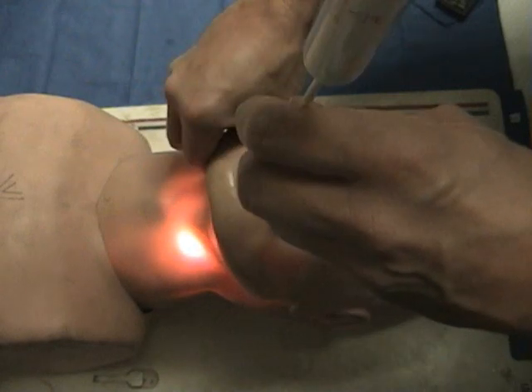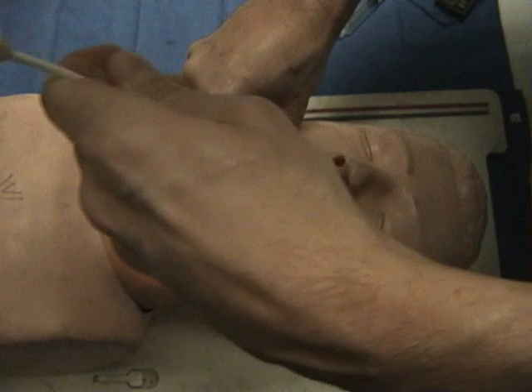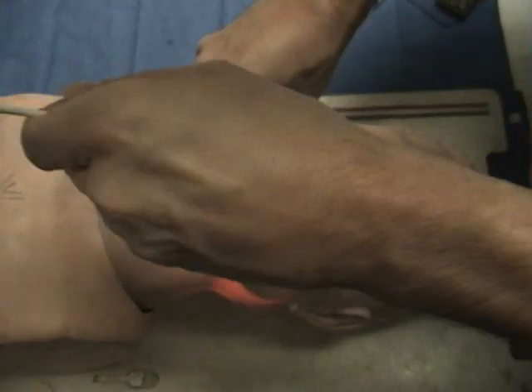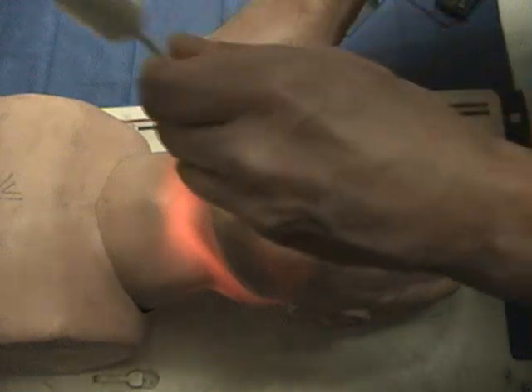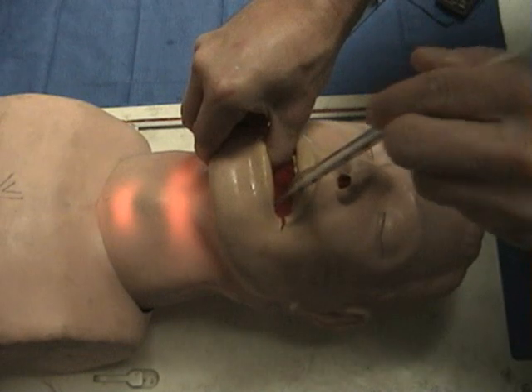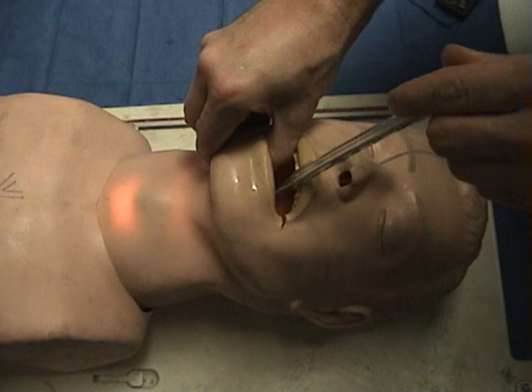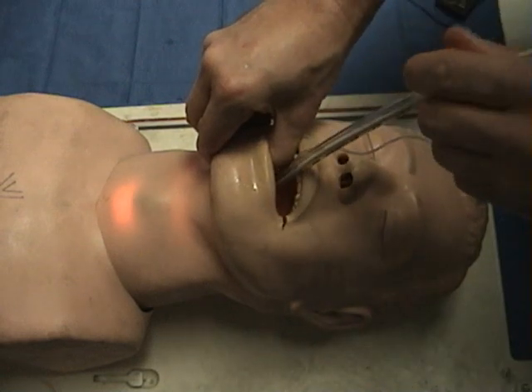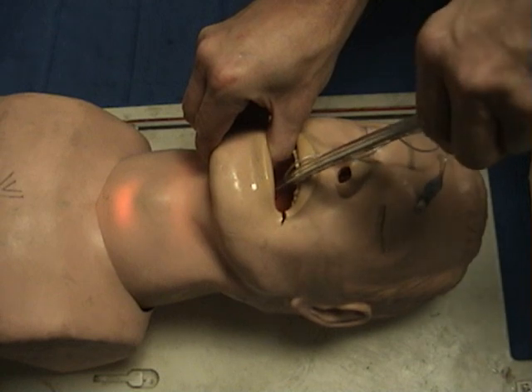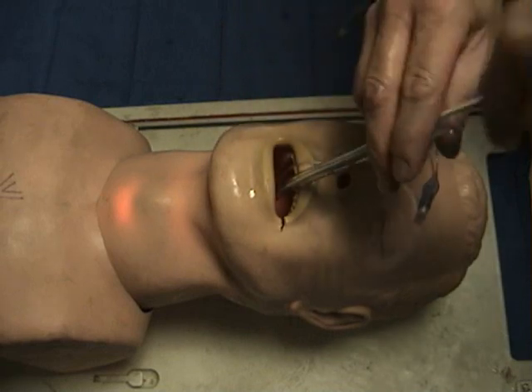By doing a scooping motion, we can see the left side of the neck being transilluminated, and then the right side. By continuing this scooping motion, we watch until the light comes from the upper neck into the lower neck and into the trachea. This is a signal that the tip is beyond the laryngeal inlet and the vocal cords. Once we obtain that, we slide the tube and then we withdraw the stylet from the endotracheal tube. This is a typical light of a successful intubation.